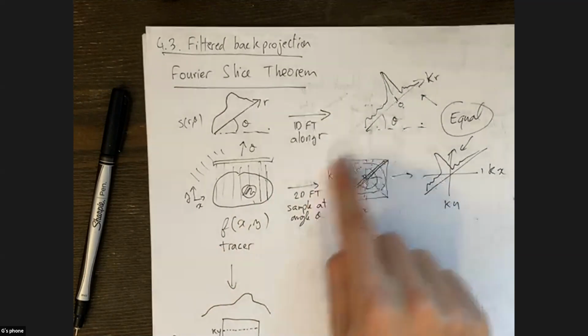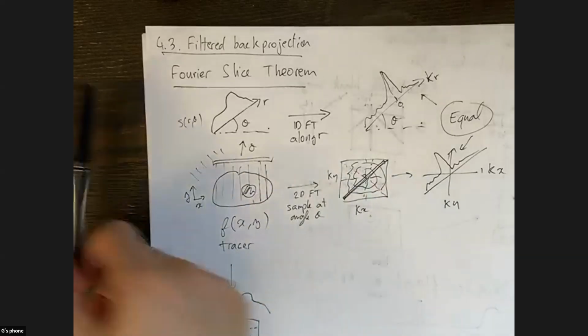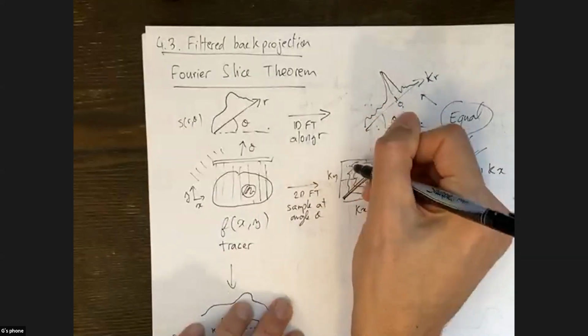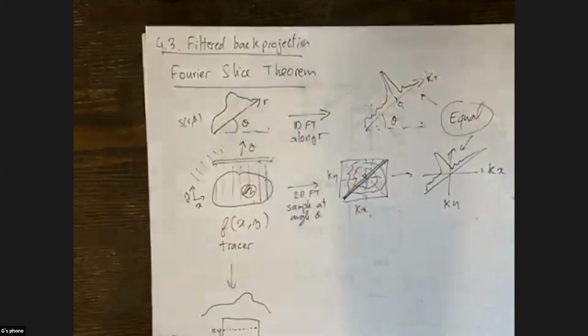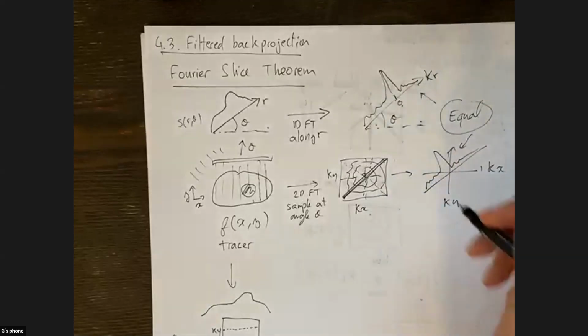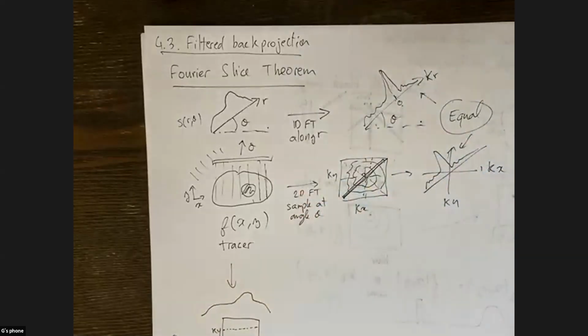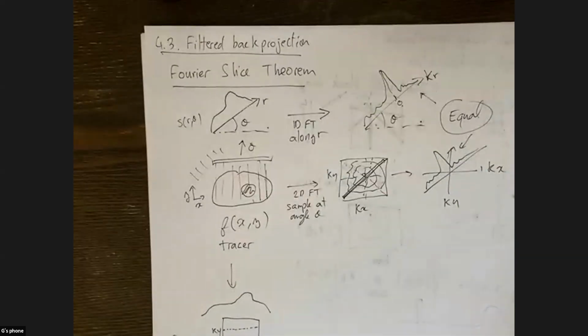And once we have the full spectrum, there's an inverse Fourier transform that allows us to go from the frequency domain back to the spatial domain, and therefore we can obtain a full accurate reconstruction of the image. The other thing is, because the spectrum is symmetrical, we really only need 180-degree coverage of the distribution to get a full reconstruction, right?